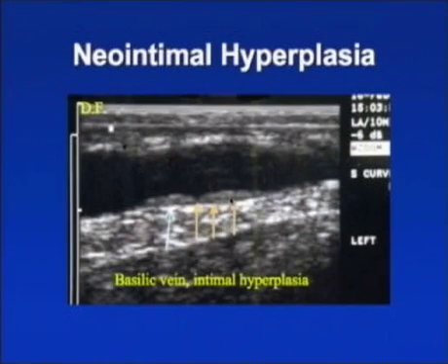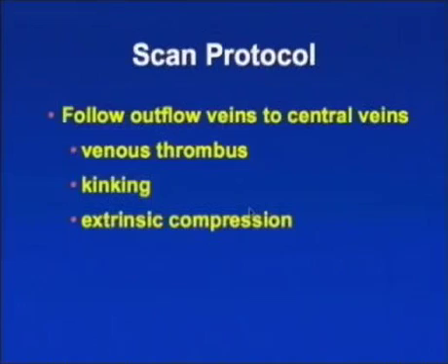We can see the thickening of the intima right through here, which is pretty unusual to see in a vein. Normally we don't see the vein wall in ultrasound. So if this goes on to significantly stenose the outflow vein, then a whole plethora of different hemodynamic situations occur.